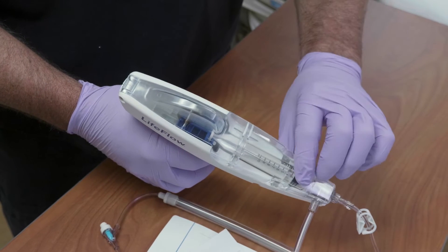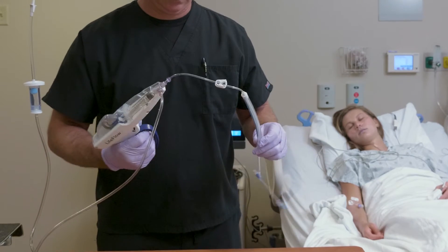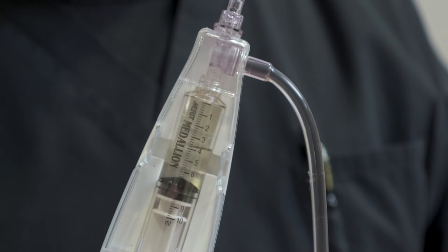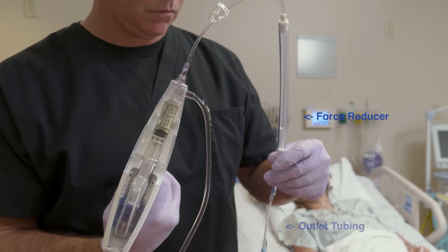Close the canopy and remove the foam trigger lockout. Now, with the LifeFlow pointed upward, cycle the trigger until all air has been purged from the syringe and tubing. Continue cycling until the force reducer and outlet tubing are primed.